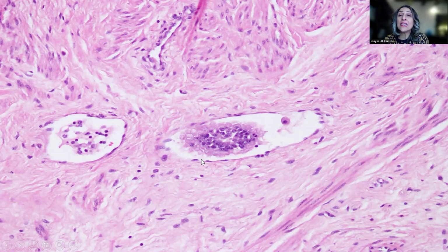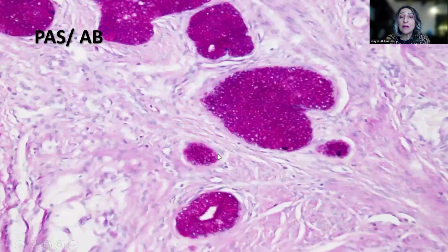Lymphovascular invasion is extremely common. Something like 50% of the cases would show lymphovascular invasion. And in this case, we have the vascular space, and then we have the tumor cells attached to one side with the wall of the lymphatic space and growing inside.